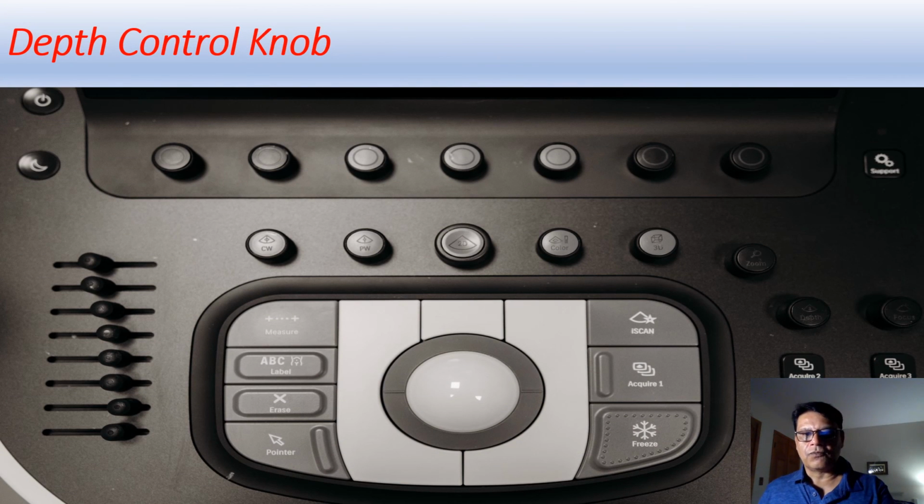So if you see, here is a knob, this one, and it says depth. On the console of the ultrasound machine, a sonographer can change the depth of view or scanning depth by moving this knob according to the requirement of the scan.